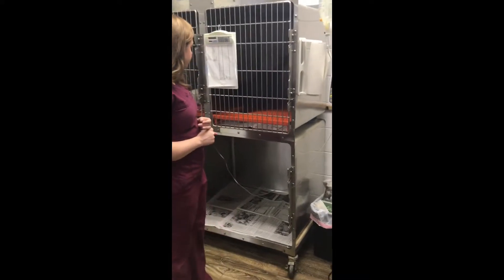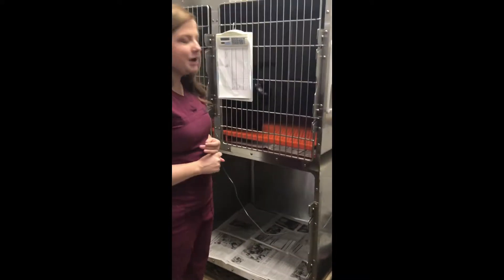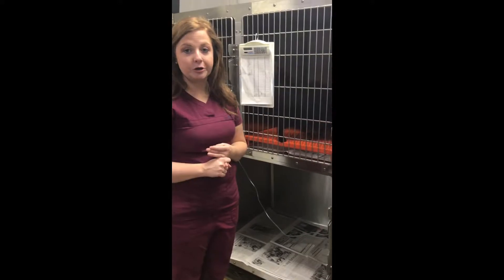This is Debbie Gray and this is task number 16. We're doing a TPR and an auscultation on a cat — we're just gonna call her Kitty.